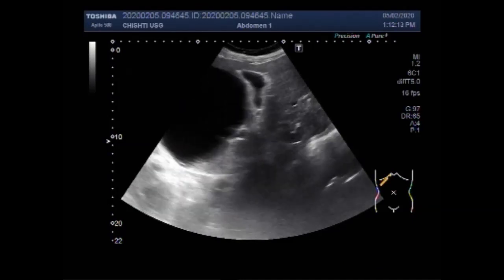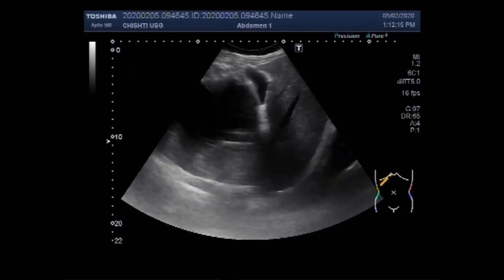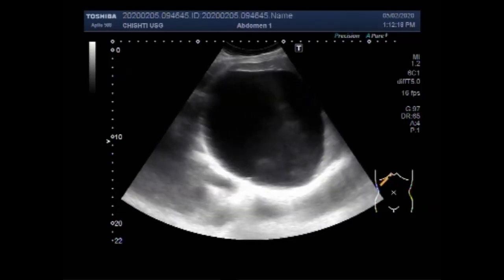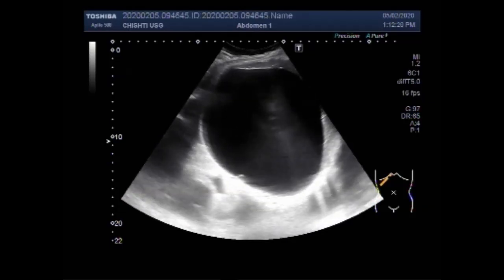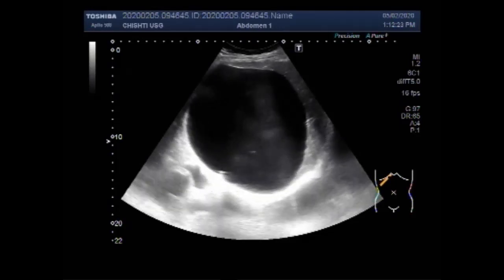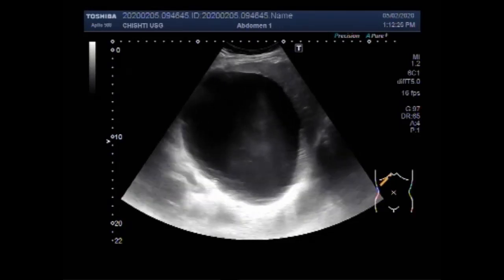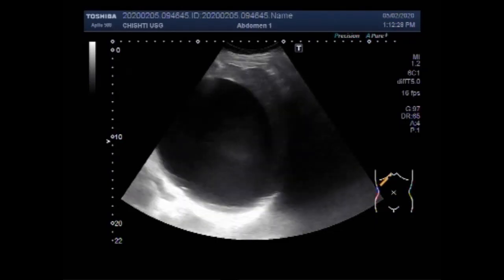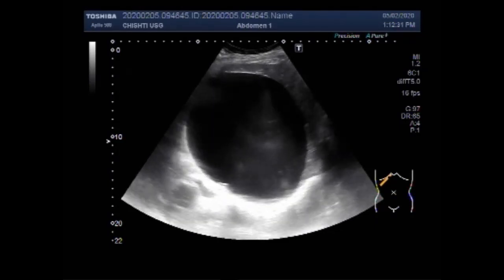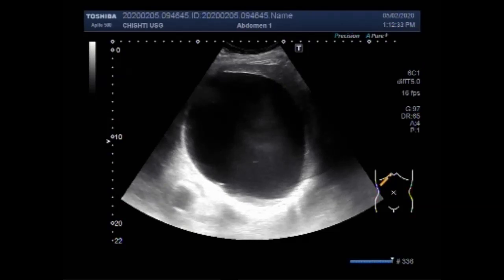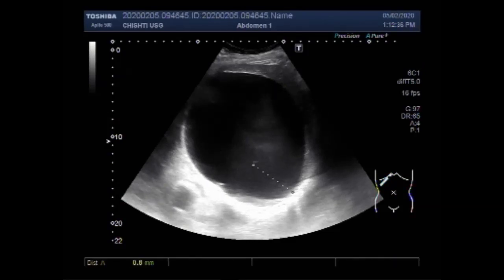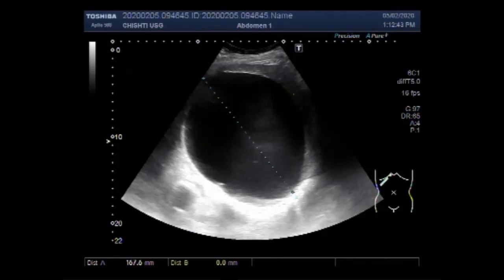The cysts are usually found by ultrasound or CT scan. They are typically round or oval in shape and have well-defined margins. You can see a large hepatic cyst in the left lobe of the liver. On ultrasound, they may appear as round or oval, anechoic lesions — possibly lobulated, well-marginated, with a thin or imperceptible wall and a clearly defined back wall.